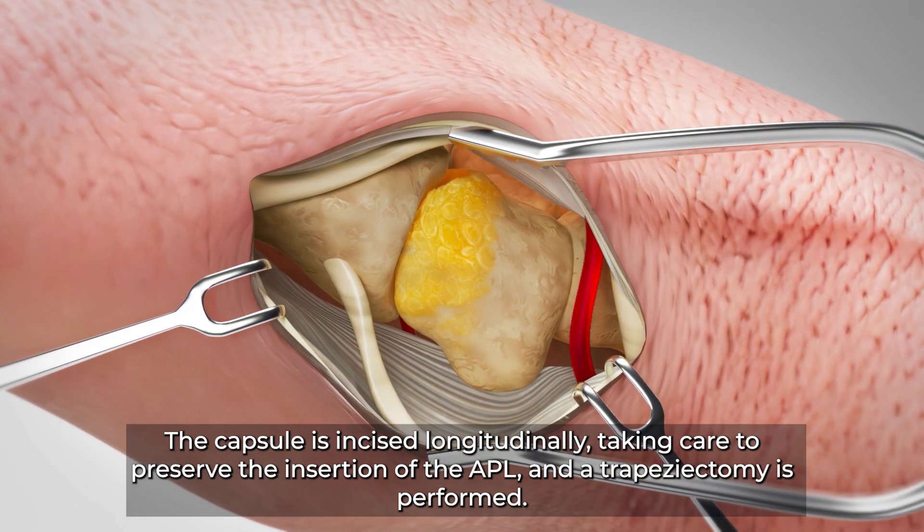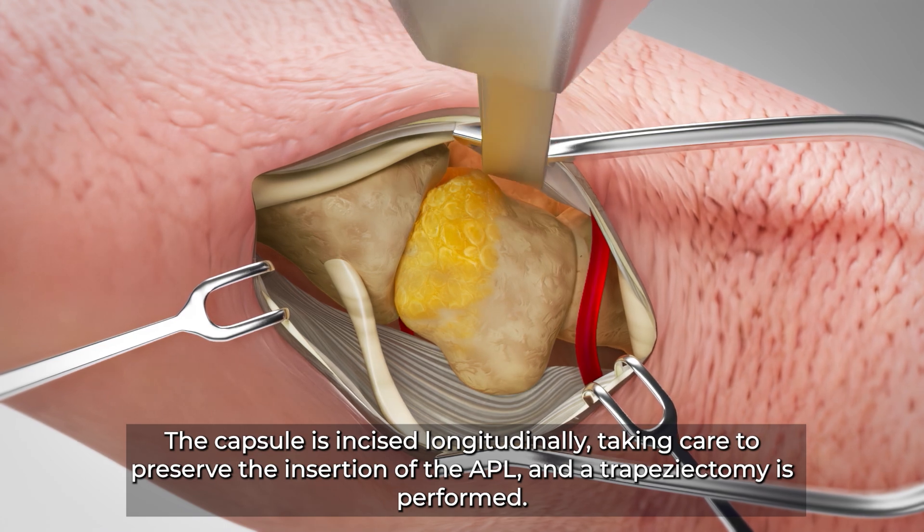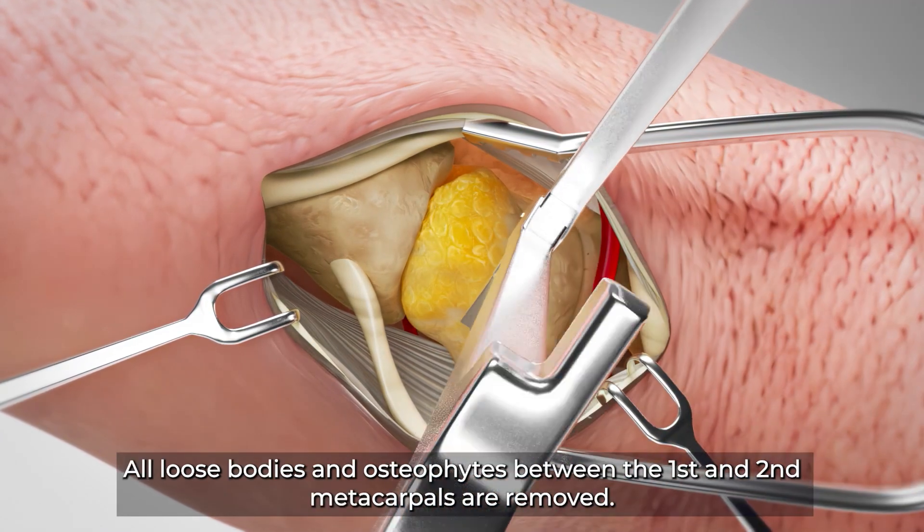The capsule is incised longitudinally, taking care to preserve the insertion of the APL, and a trapeziectomy is performed. All loose bodies and osteophytes between the first and second metacarpals are removed.